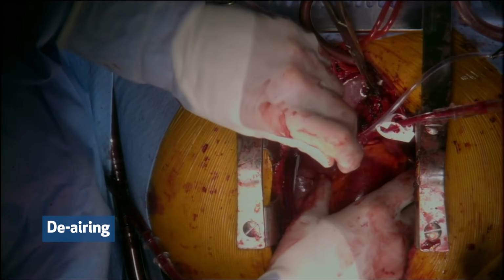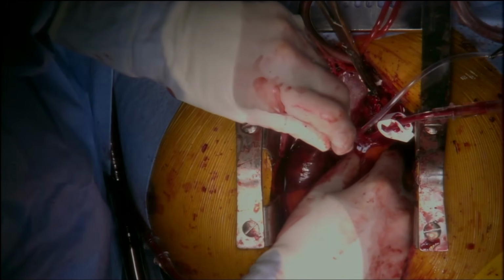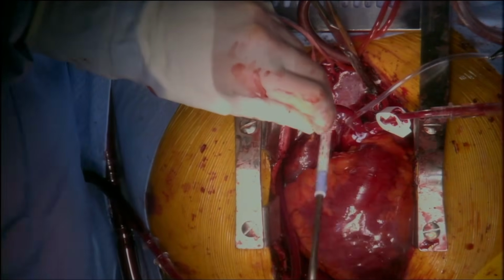After careful de-airing, the clamp is removed and the heart is back in sinus rhythm.